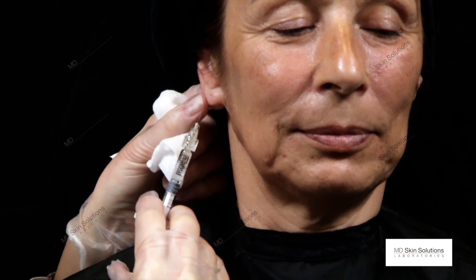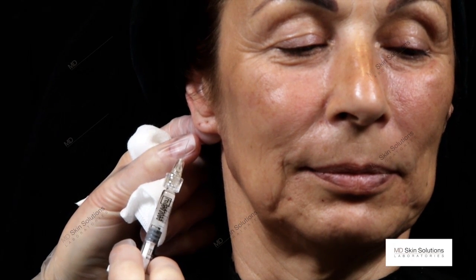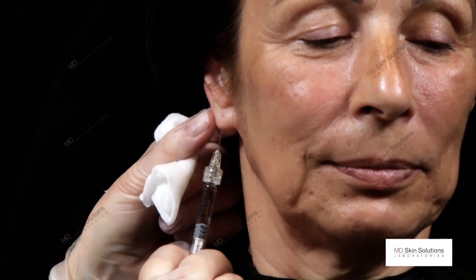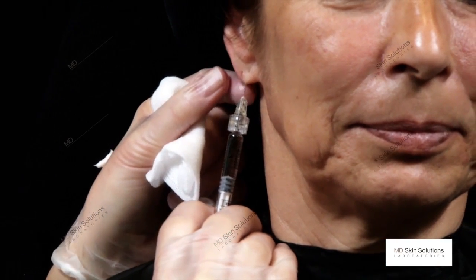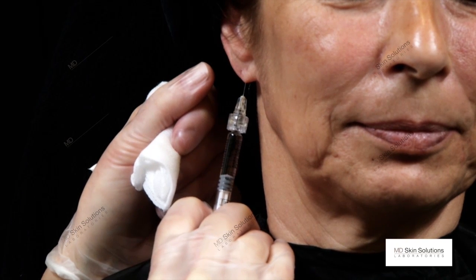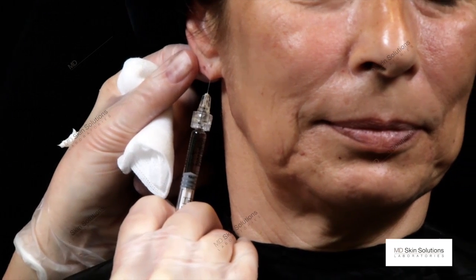We will inject the earlobe here because a loss of volume marks an aging overall, or is the giveaway for aging. So what we do here, we simply replace by Pluryal, inject slowly a kind of a bolus at the low, and the entry point is the lowest point of the earlobe.